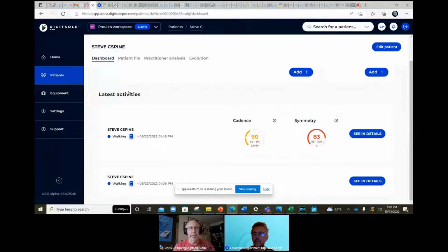So after someone has already completed the test, we look at an analysis and we use an analysis with a specific pathology to review the process of how to look at the analysis. So today's analysis is, again, going to be focused on walking.